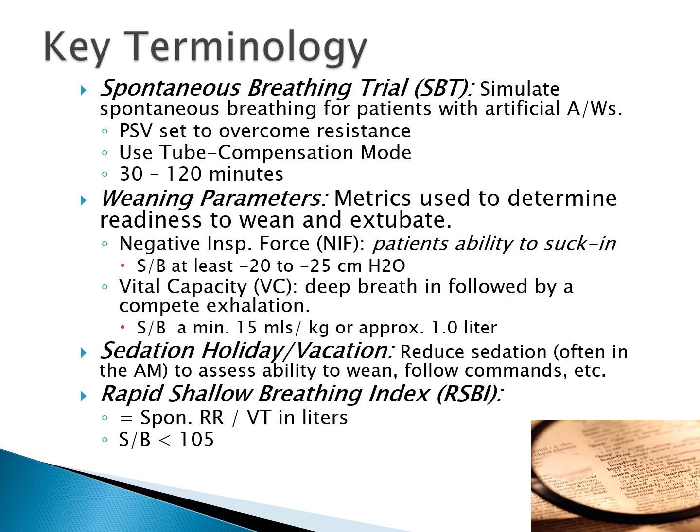Now let's take a look at some key terminology related to spontaneous breathing trials and extubation. So the first one is what I've just alluded to, and that is a spontaneous breathing trial, where we as clinicians simulate spontaneous breathing for patients with artificial airways who are on mechanical ventilation. Typically there are a lot of approaches you can take. One of them is you can calculate the resistance that's imposed on the patient by the artificial airway and dial in a pressure support to overcome that.